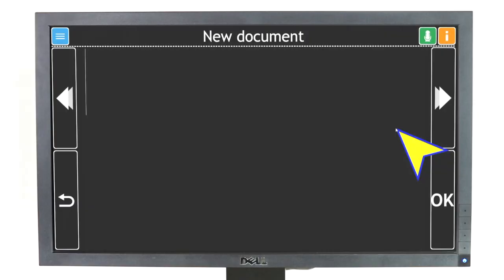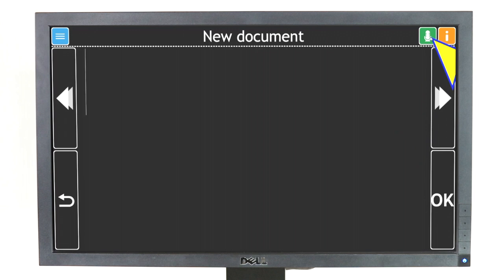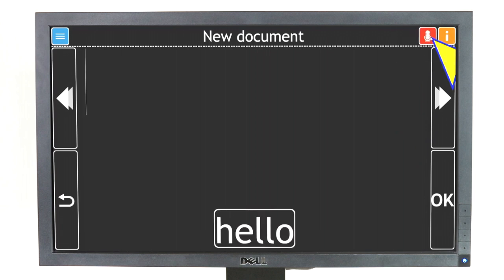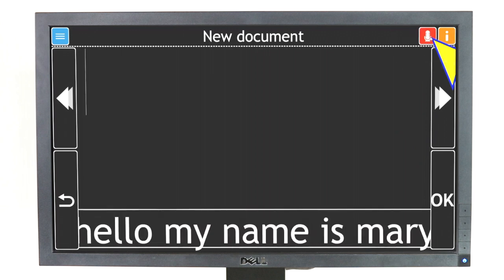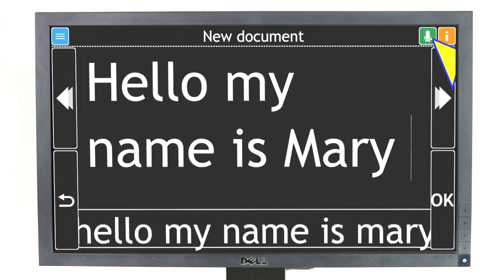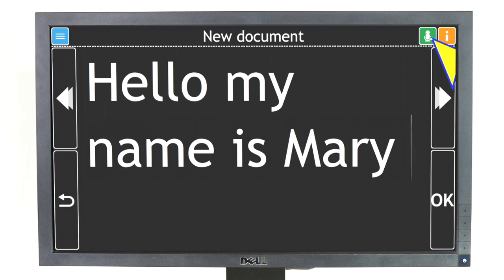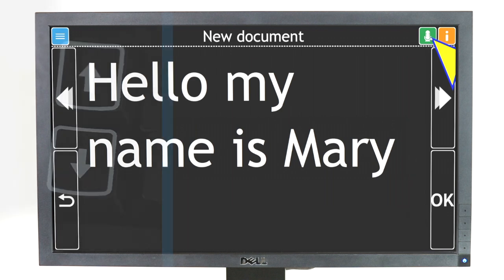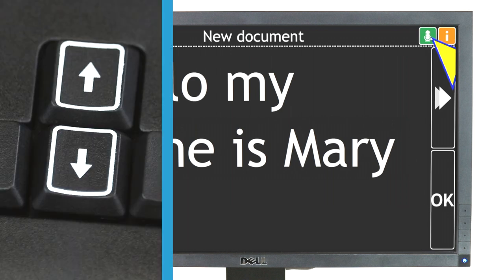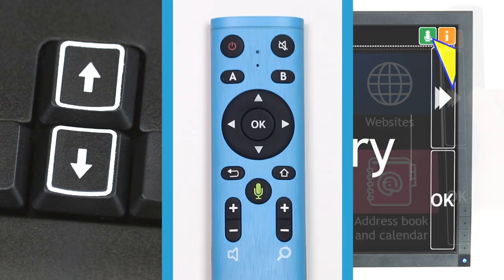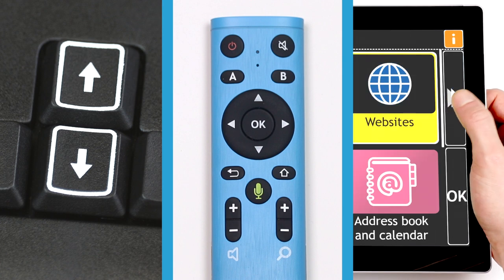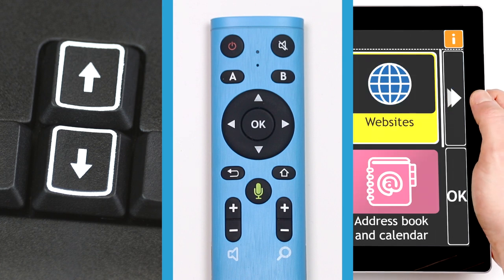In this video, you'll learn how to dictate your text using GuideConnect's Voice Input. When using Voice Input, you will still need to navigate GuideConnect using either the keyboard, remote, or touch screen controls.